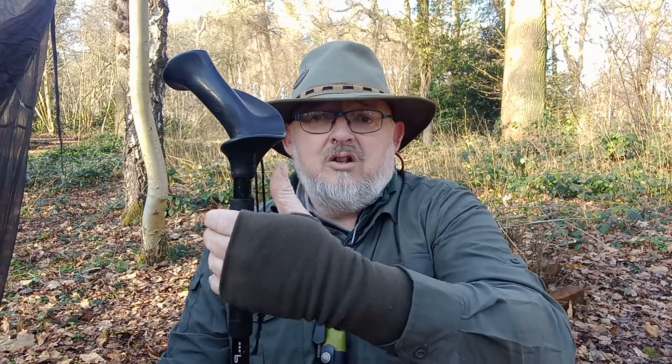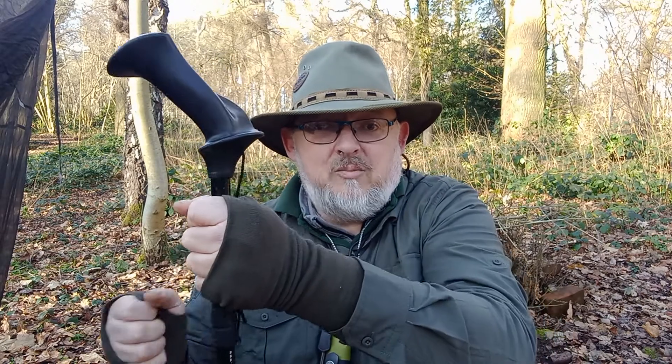All you really need is to place your hand on the back — I have issues with my hands so really I just need my thumb there and four fingers there. I don't even need these last fingers but they wrap around. As you walk, your arm straightens, your upper arm goes up, which moves your shoulders into the correct position and in turn straightens your back. So when you're carrying a pack it all aids with weight distribution.